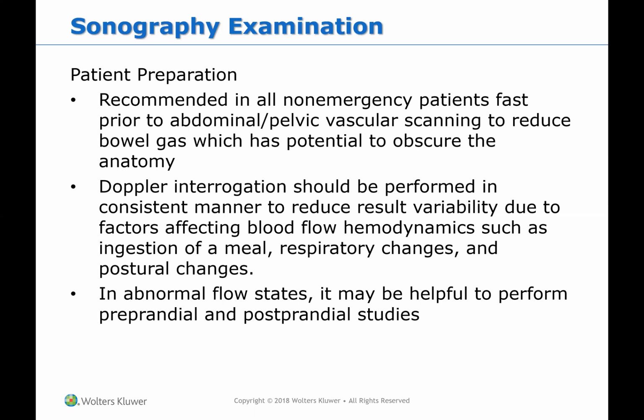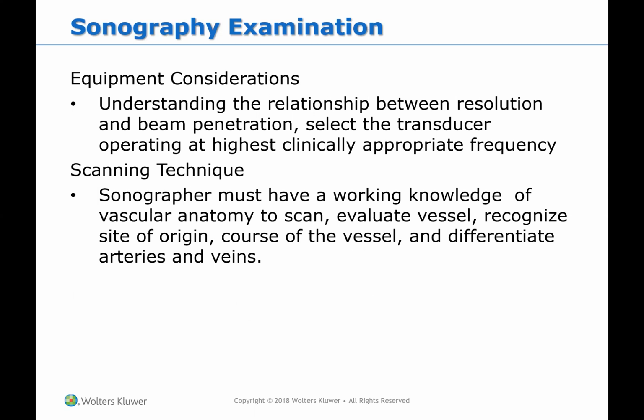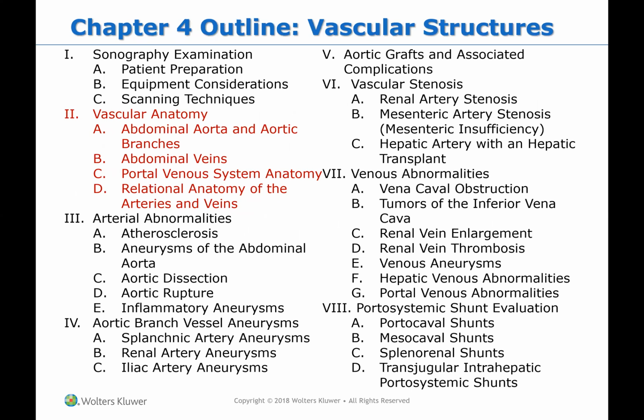Sometimes in some studies they want the patient to eat afterwards so we can see the vascular flow of the SMA, which we're going to go over today, and how it's affected by meals. So this is pretty straightforward stuff.